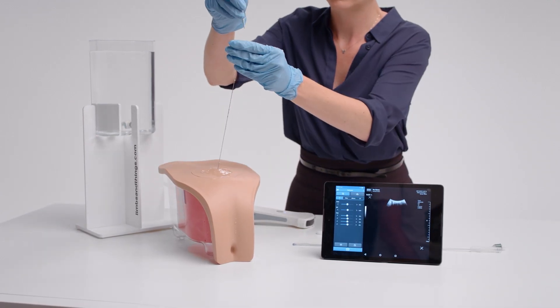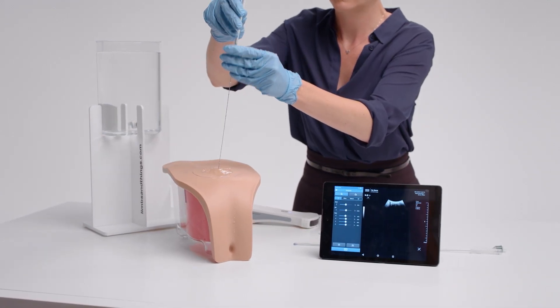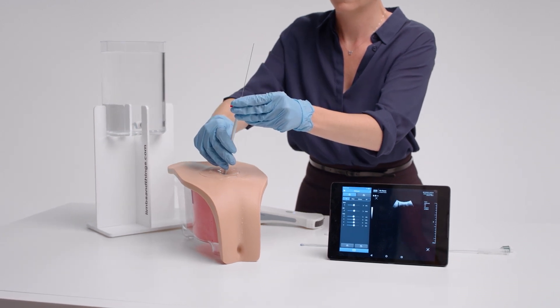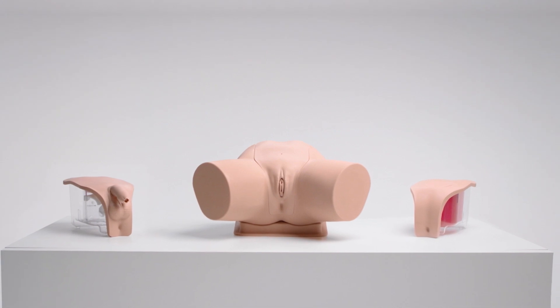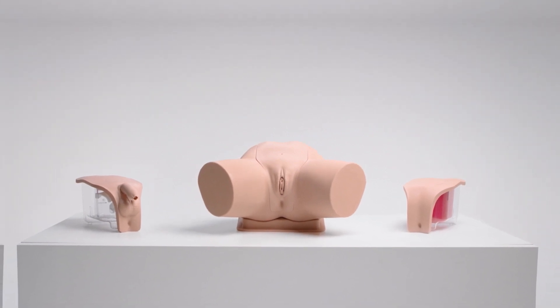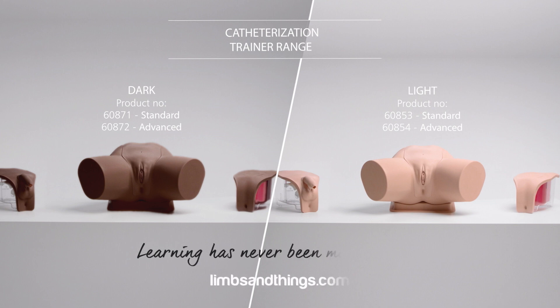A full bladder scan can be done to confirm the need for catheterization. The latest catheterization range from Limbs and Things is a cost-effective, closer-to-life training platform that provides hands-on experience for all levels of learning.